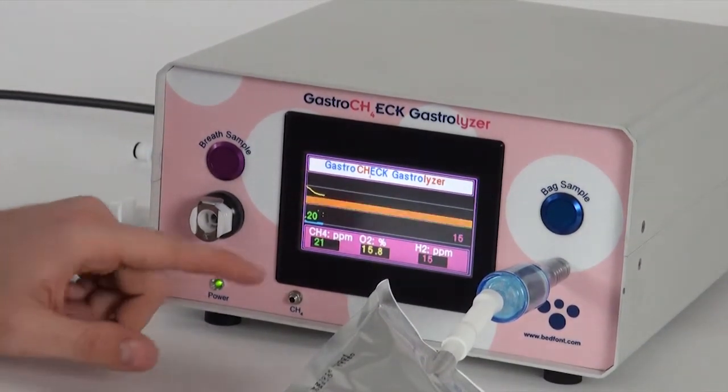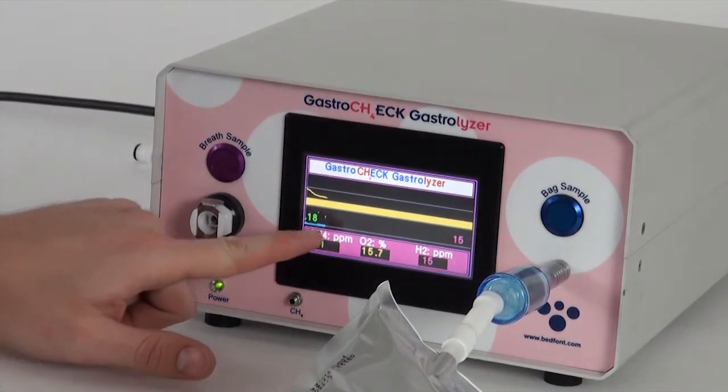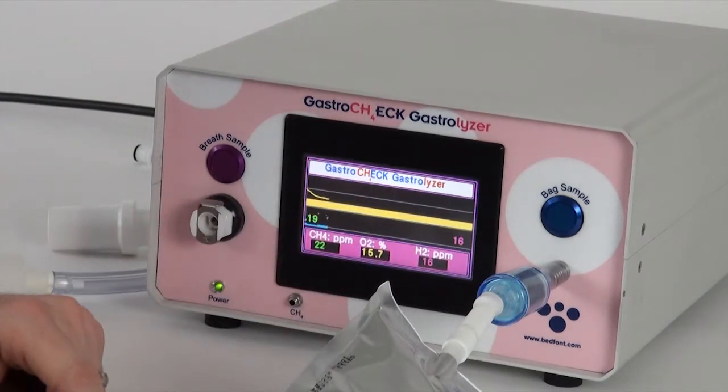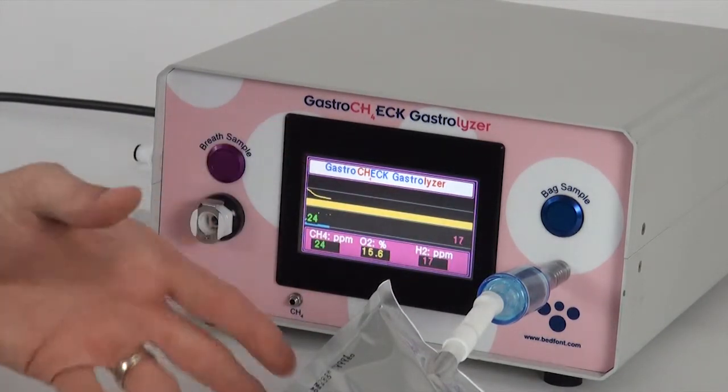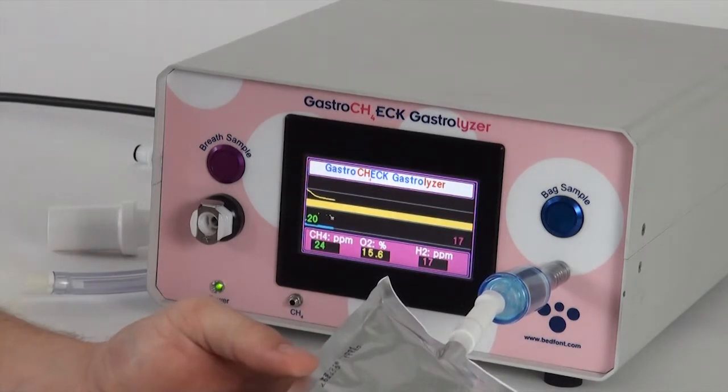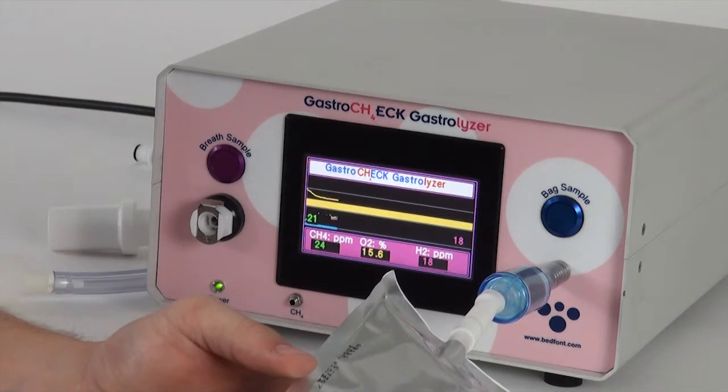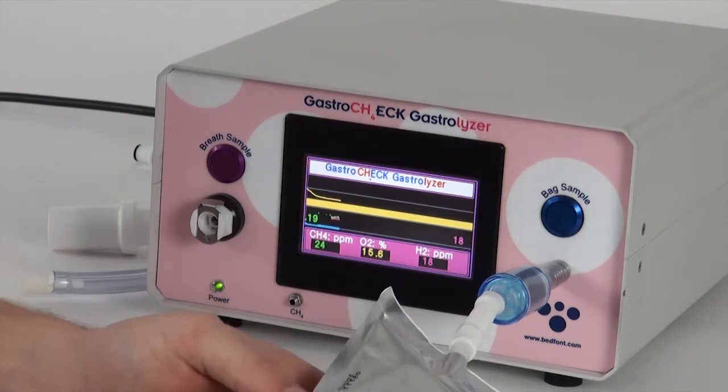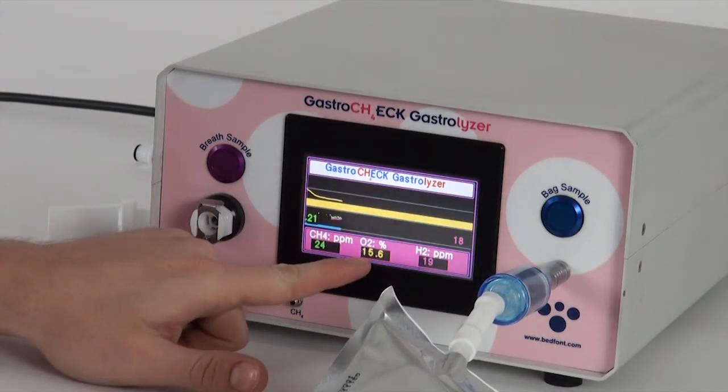So the sample's now started. You can see the bar on the screen there which is showing how good the end-tidal sample is and the CH4 values and the H2 values on there as well. The monitor will draw the sample from the bag itself so there's no need to squeeze the bag or anything like that. The pump will take as much sample as it needs in order to do the calculation.